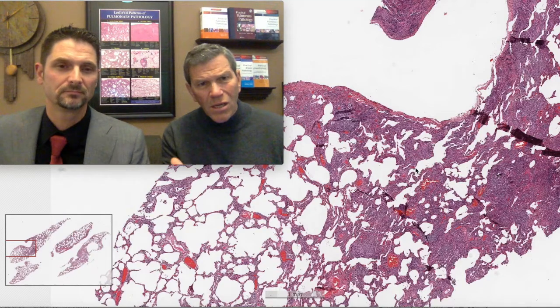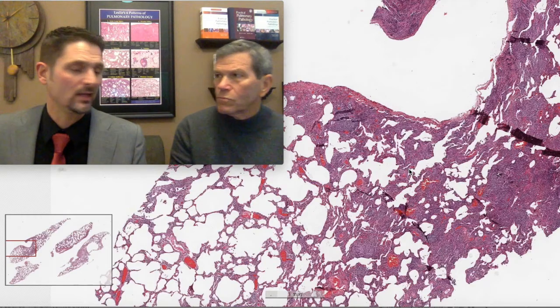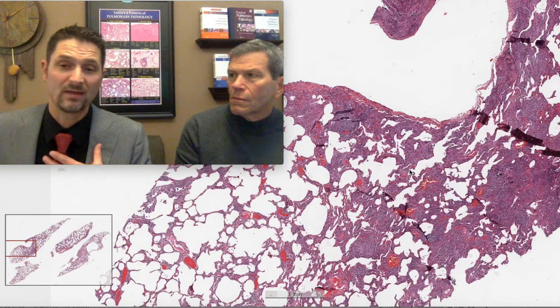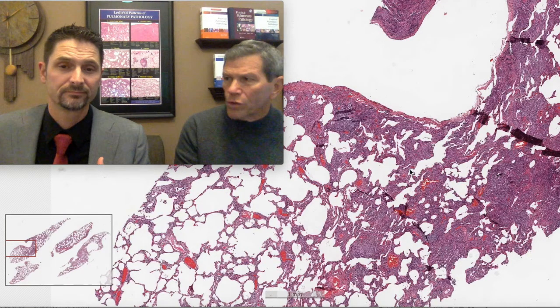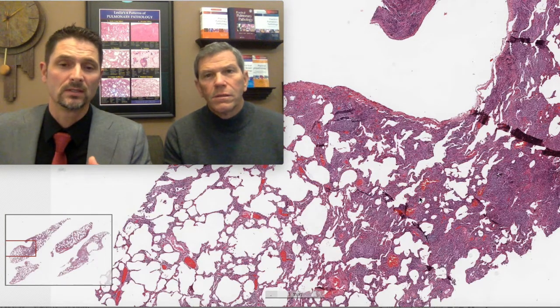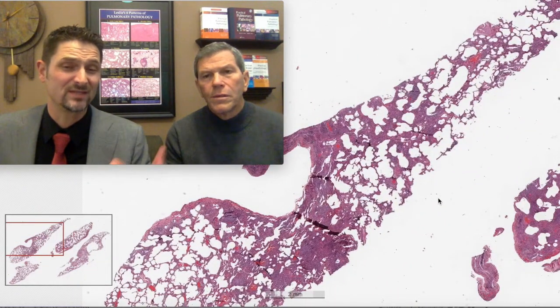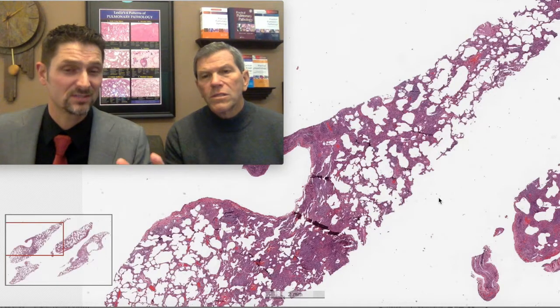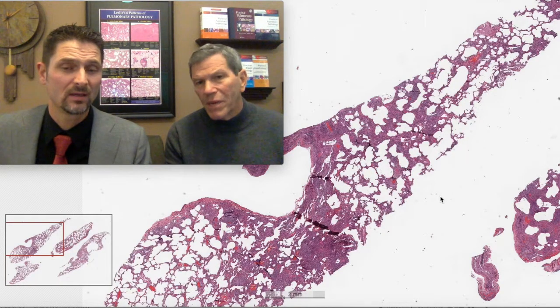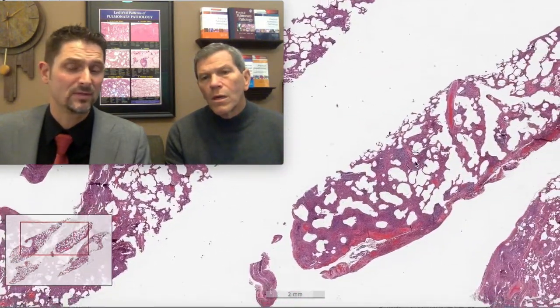They can have cysts on lung CT, and they have cellular interstitial infiltrates that you might squeeze into the category of LIP. So how do you handle LIP? Me personally, I've never made a diagnosis of LIP. Well, you swore you never would. Exactly. You've been true to your swear. So if you wanted to put a general pattern on this, I'd say it fits best with a robust cellular NSIP pattern, accompanied by small, non-necrotizing granulomas, and to me, pleuritis.